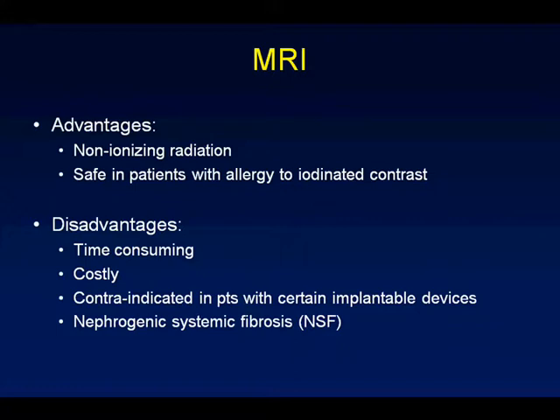Our most common indication in terms of body imaging is appendicitis, and we do that without contrast. Certainly it's safe in the second and third trimester, because that's when they actually also do fetal MRI, looking for congenital and fetal anomalies. The first trimester is questionable. So far there is no harm, as we are aware, for the first trimester. But for first trimester scanning, we still need written consent from the patient, and basically consent states that we are not aware of any known harm to the embryo at such an early stage. And most patients consent to it.